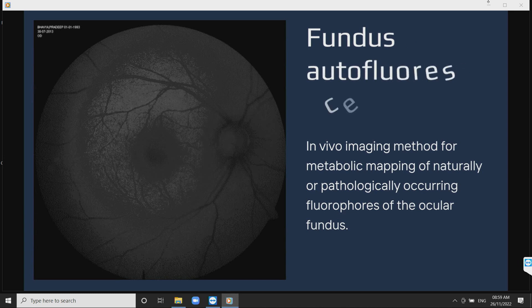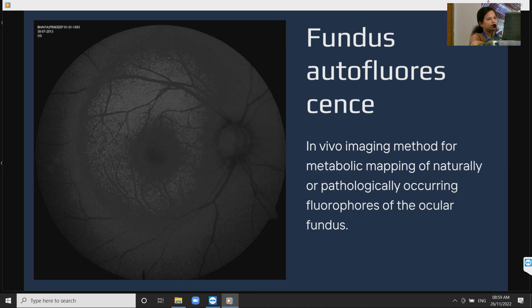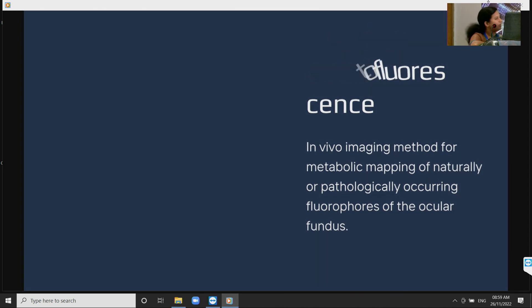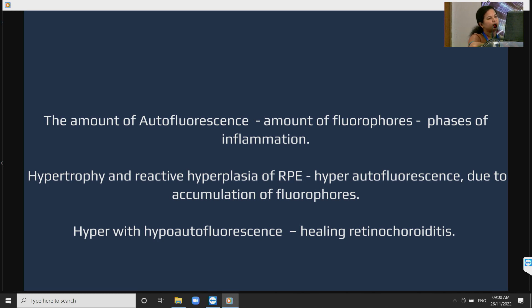Now comes fundus autofluorescence — it is an in vivo imaging method for metabolic mapping of naturally or pathologically occurring fluorophores of the ocular fundus. The amount of autofluorescence depends on the amount of fluorophores, which again depends on the phase of inflammation. In the active phase it will be hyper-autofluorescent due to increased fluorophores, and in the healed stage it will be totally hypo-autofluorescent.